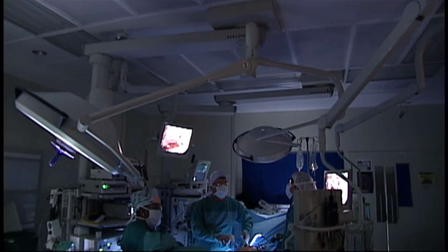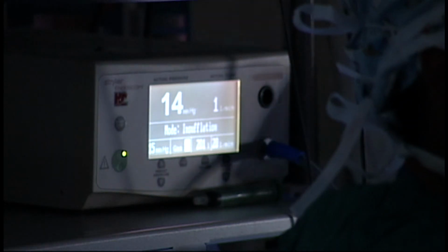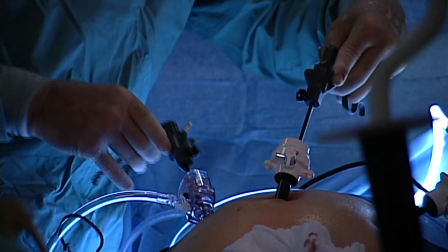So if the system that's going to take the image could communicate with the anesthesiologist and the equipment controlling the breathing, it might be possible to hold the breathing for an extra long moment in order to capture the image. Because of the danger in manipulating surgical equipment as critical as life support systems, surgical teams need to know the framework is monitoring the entire system with the patient's health as paramount.